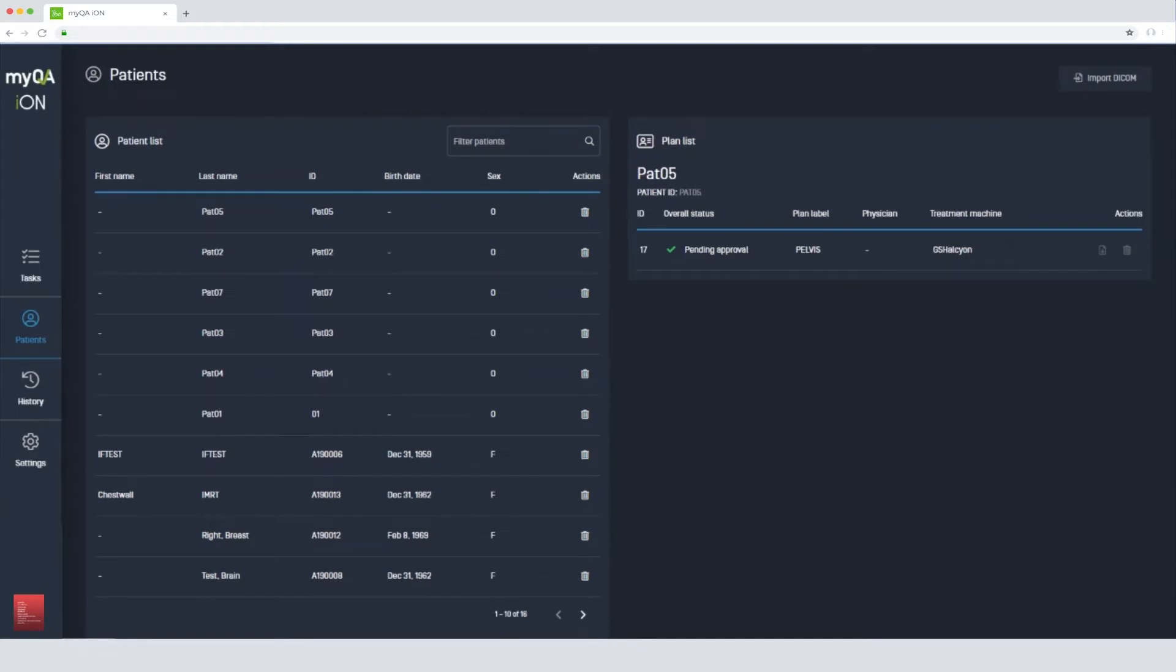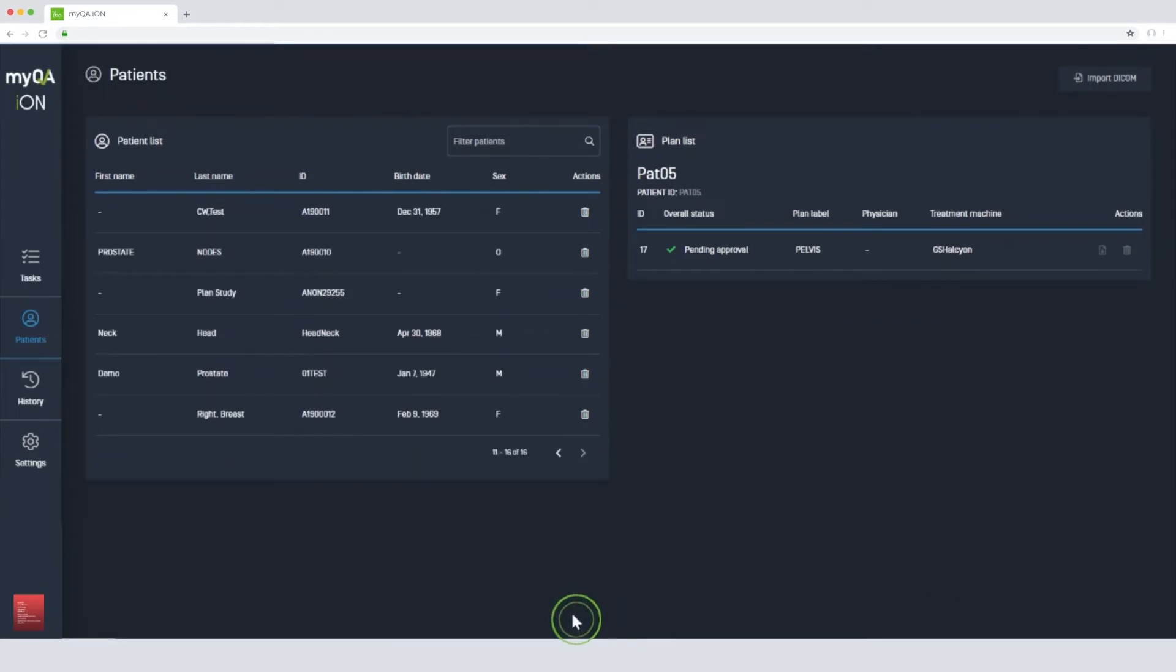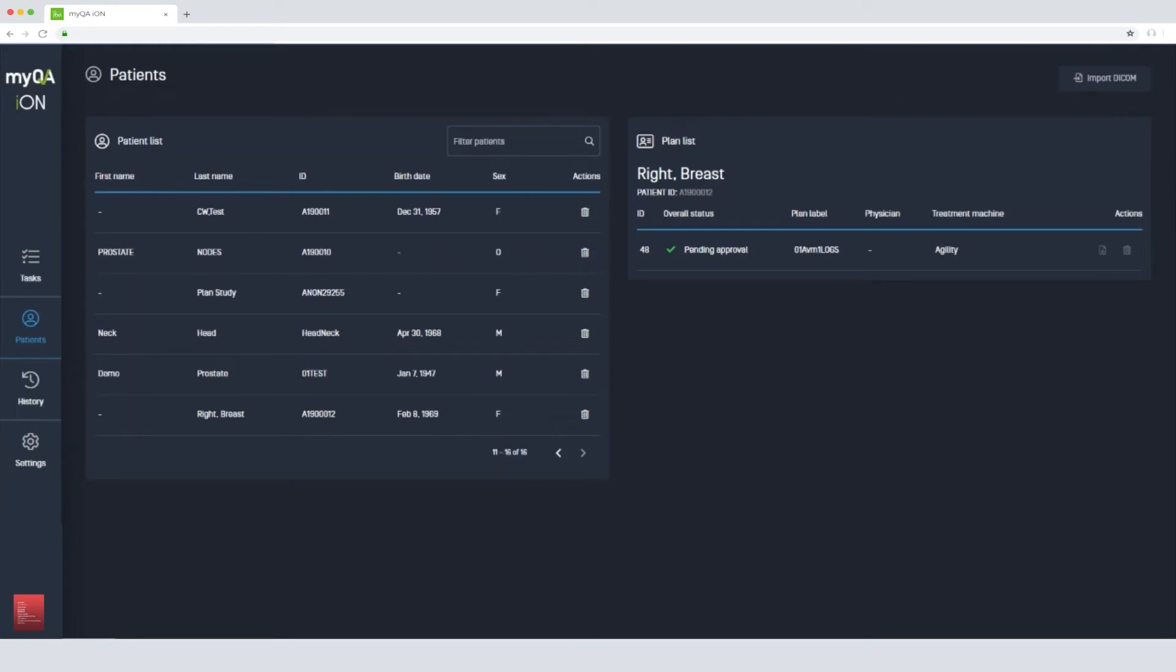As soon as the plan has been imported to the system, MyQA ION automatically starts the Monte Carlo calculation. The dose is calculated within minutes, and plan analysis is launched automatically without any need of user interaction. This ensures the system is working efficiently and you do not have to wait for your results.